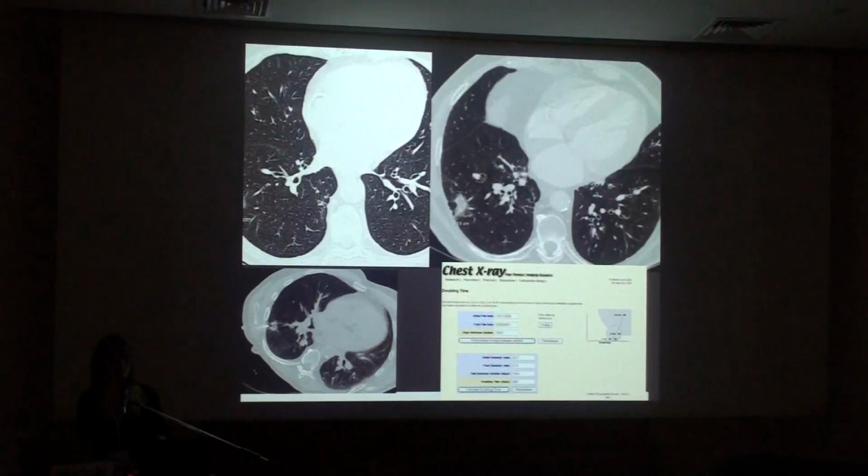This patient had been followed up for 3 years, and each radiological report was okay, the lesion is stable. And so when he came to our institution and I reported it as a lung cancer, he was not convinced he had a lung cancer, and so I did the biopsy just to convince him that he should be operated on, and then he accepted to have a right lower lobectomy.